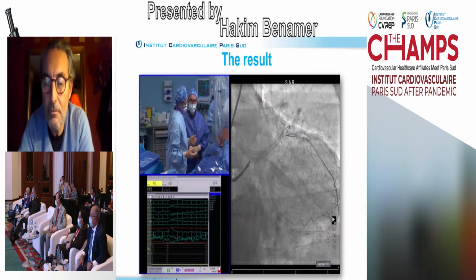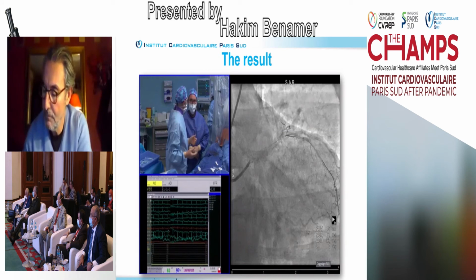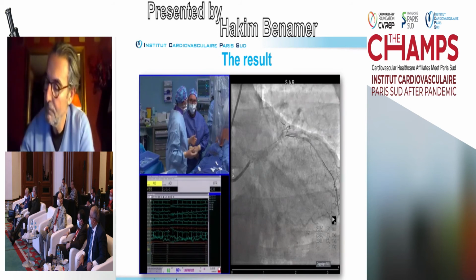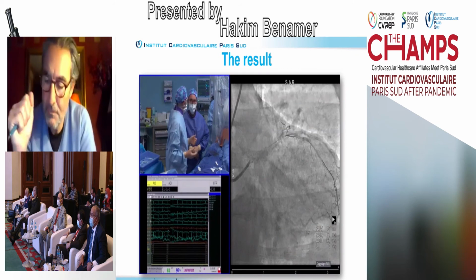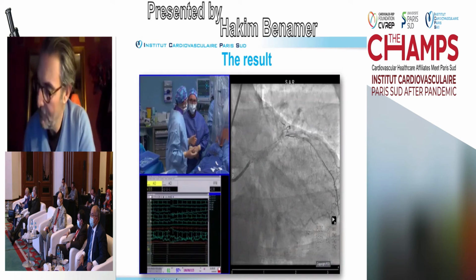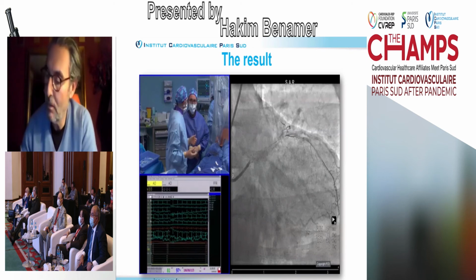But let me ask you as well as the panelists about two situations in bifurcation and how to deal with them. If you have lost the diagonal completely, and it's a very important branch, you have lost it and you couldn't cross, what are the tips and tricks you're going to use in order to regain the diagonal, the side branch? Let's start with the panelists. Dr. Sayed Ghizi.